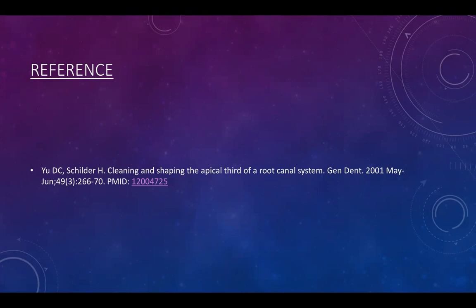The bounce back of a fine file when encountered by resistance or barrier is actually bouncing. And the last one, which is the repeated reintroduction and reapplication of the previously used smaller files after irrigation, is recapitulation.